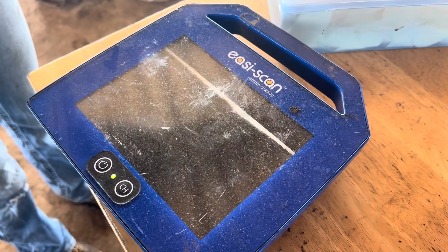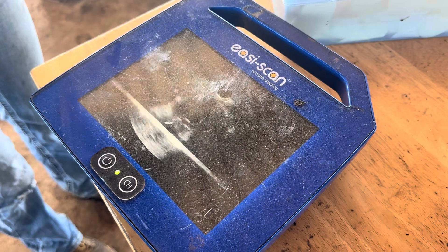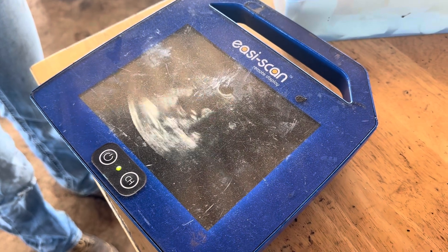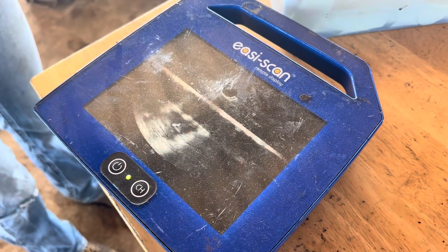Is that B1? So, black is fluid. And that's a little bit of the cap quite down yonder. And then there's quite a lead there. So that's a bit of a hint. What do you reckon? AI. So it's quite a large cap, but it's kind of hard to see.